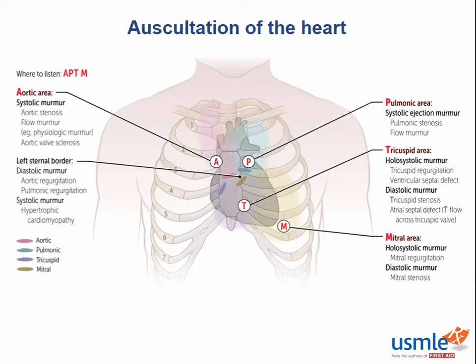On your exam, there is a high likelihood that you'll be presented with a clinical vignette of a patient with cardiac pathology, as well as provided a patient on an examination table in the computer module, and you will be given a digital stethoscope for you to move around on their chest to appreciate any abnormal cardiac heart sounds. You'll have to integrate the information provided in the vignette with the audio provided to gather the answer.